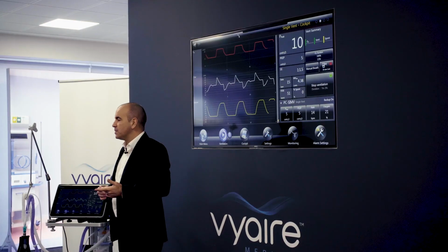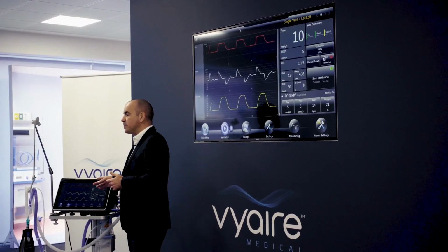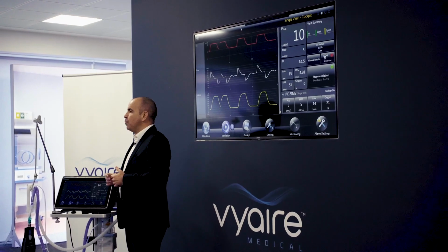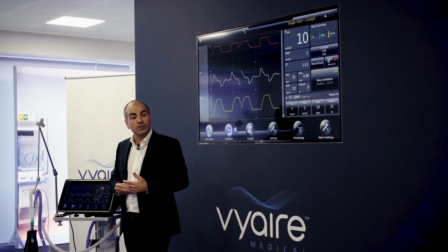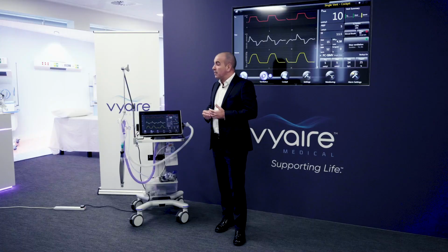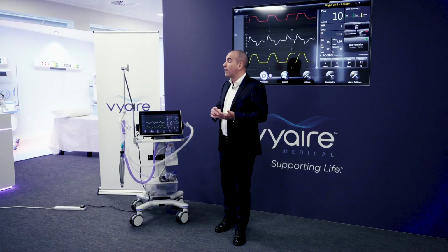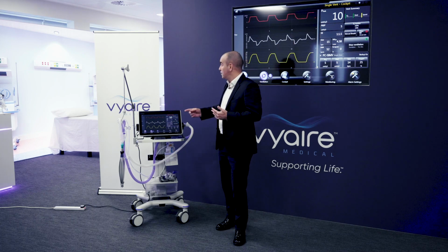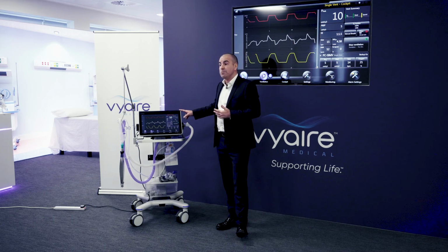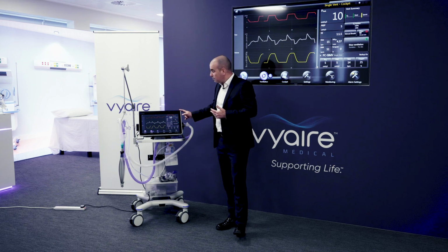The bellavista 1000 has a slightly smaller screen and has a much more pared down and tailored approach to the software inclusions on that. The bellavista 1000 has a minimum of 4-hour operating time on its battery, and the bellavista 1000E has a minimum of 3 hours.